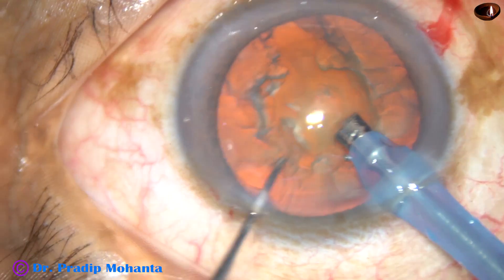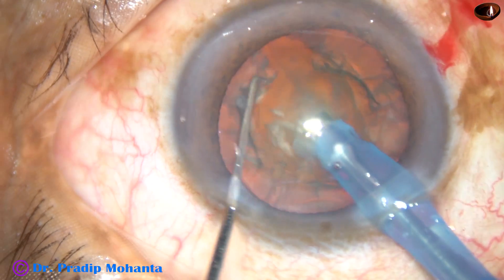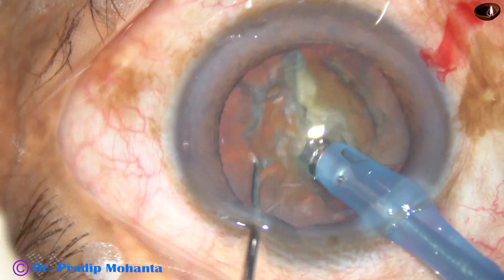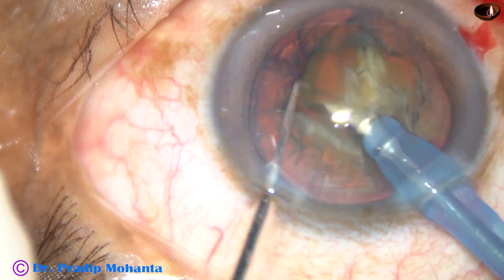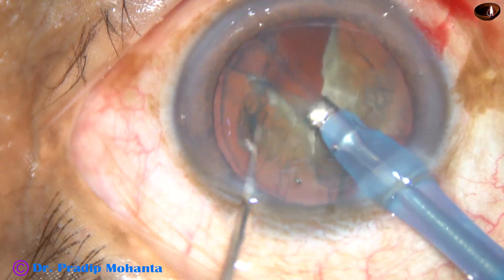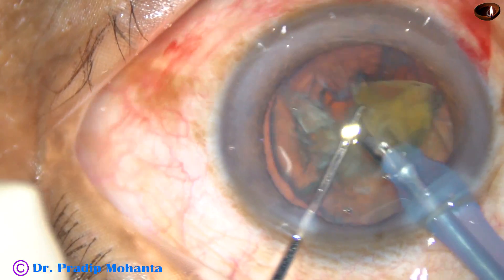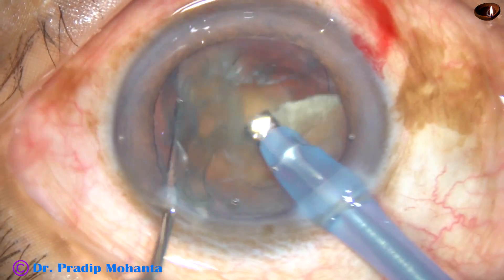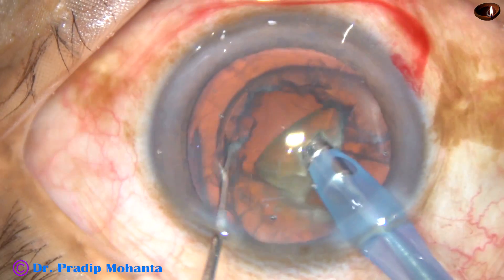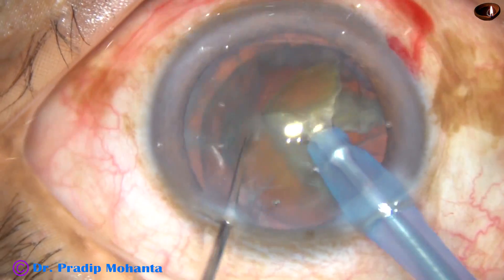I am planning to do a direct chop. The tip is buried into the substance of the nucleus. The nucleus is held very firmly, rotated, and chopped at another place. This free nuclear fragment is emulsified and taken out. In this way, the nucleus is rotated and chopped, and the nuclear fragments are removed. Phaco ultrasonic energy used in this case is 65%. Flow rate is 45 ml per minute, and vacuum is 450 mmHg.